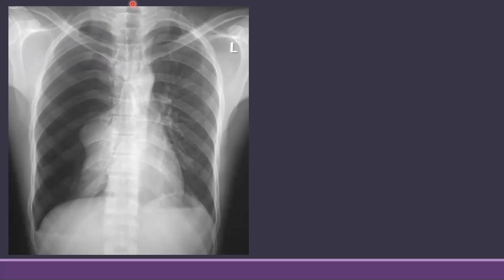If you look at other structures, you can see that the trachea is shifted towards the left side — it is being pushed by the air which is present here, pushing the trachea towards the opposite side. Similarly, the heart is also not in its normal position and is also being pushed towards the left side. These are all typical features of a pneumothorax.